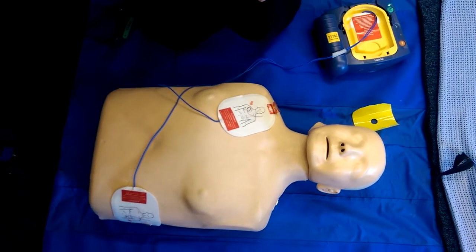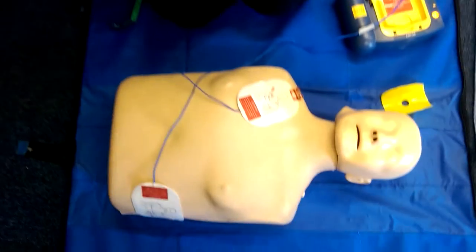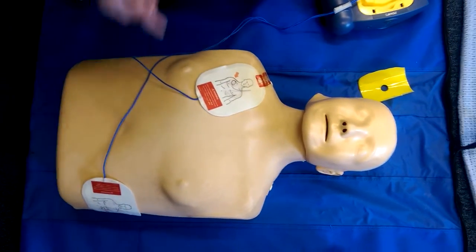Now it's going to analyze — it will detect the heart rate and heartbeat. The reason we're standing back from it is so that our own heartbeats don't interfere with the analysis. It says 'shock advised,' so I'm now going to press the button and it's going to put that electric shock through the two pads.